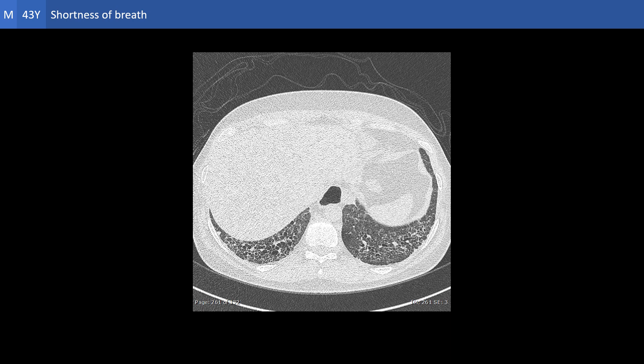These four patterns — the reticular pattern, the ground glassing, the honeycombing, and the bronchiectasis — are present in almost all types of diffuse interstitial pulmonary disease.